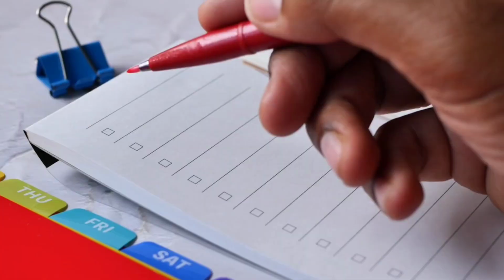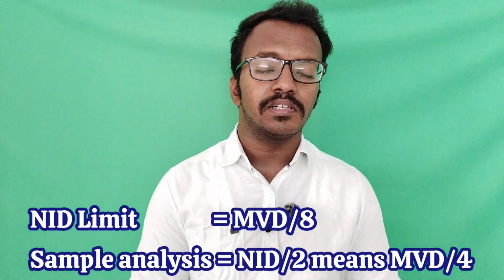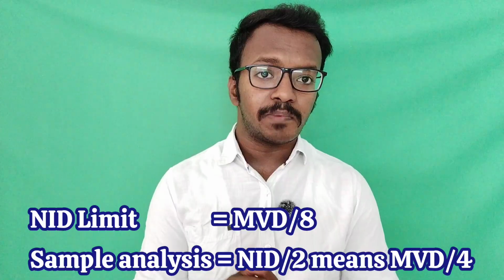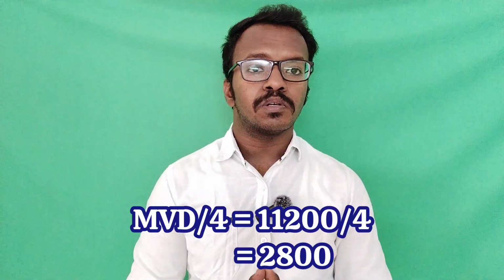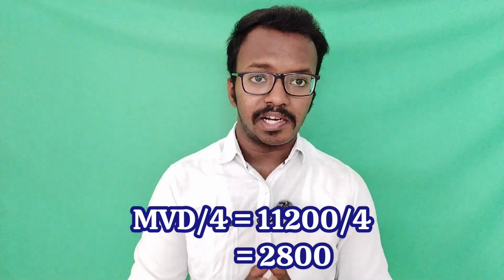So finally, in the document this is concluded as: the NID limit is MVD by 8, but for the sample test dilution for routine analysis, MVD by 4 is the safer side. MVD by 4 means 11,200 divided by 4 is equal to 2,800. So 2,800 times we need to dilute the sample for routine sample analysis. This is the way to identify the non-interference dilution in BET. And one more thing, I don't know the exact NID limit for thiamine hydrochloride injection. I provided it just as an example.